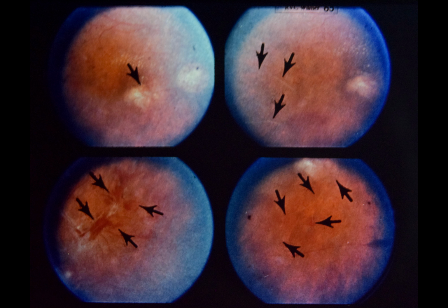Because the fluorescein angiogram demonstrated extensive capillary closure throughout the fundus, he was treated with scatter-type argon laser photocoagulation in an attempt to obliterate areas of retinal hypoxia, to promote regression of existing neovascularization, and to reduce the risk of recurrent vitreous hemorrhage. The technique and results of this treatment are seen in the following slide.